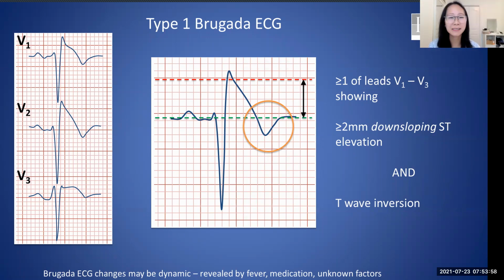Okay, thanks. And sorry, Charlie, another question: sometimes your baseline is so varying, how would you then determine for those types of ECGs whether or not you'll see a Brugada pattern, because you can't isolate what the baseline would be?